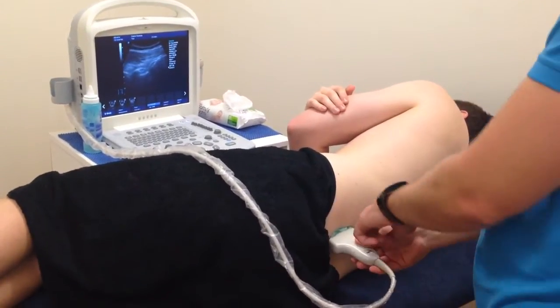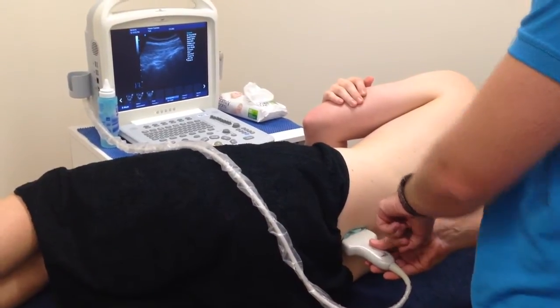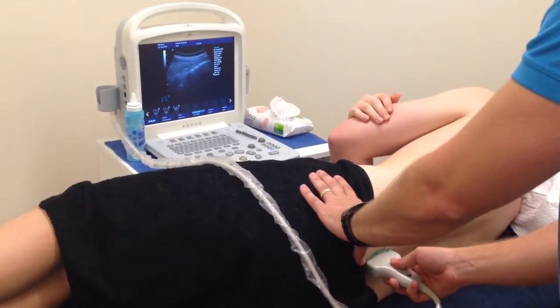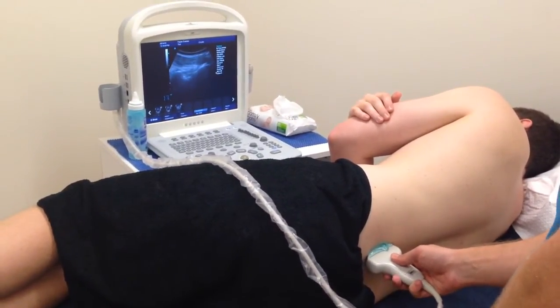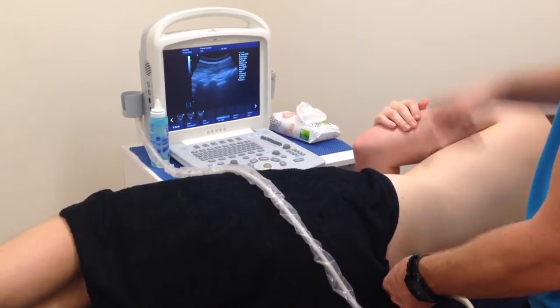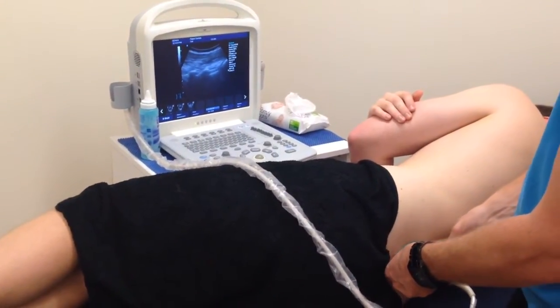With Multifidus, we're still keeping the convex probe, and we're still going to point that little marker up towards the patient's head. So the left-hand side of the screen is actually going to be the head side of the patient. And what we're going to start with is a longitudinal or sagittal view of the Multifidus, and what it's going to give us is a Loch Ness monster type of appearance, with the spines of the Loch Ness monster being the facet joints of the lumbar spine.